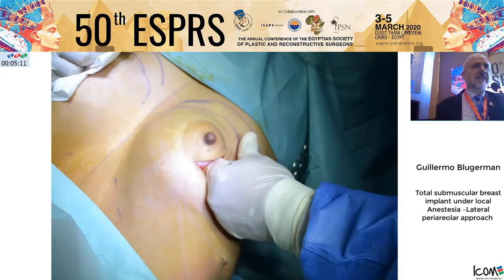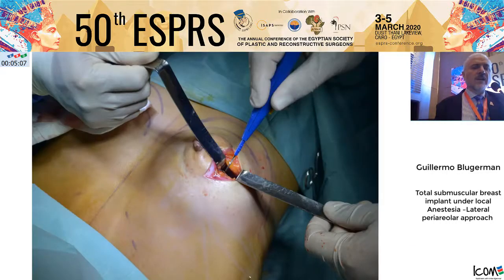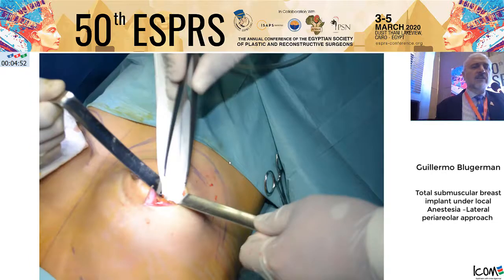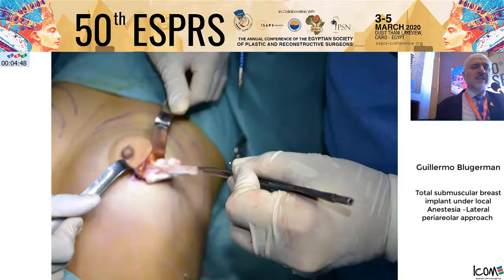The submuscular plane is already dissected by the tumescent solution. With the finger, we complete the entire pocket in just one minute. The only non-expansible area is the fascia of the pectoralis, so we cut the fascia and aponeurosis with the cautery. We place some gauzes and move to the other side.